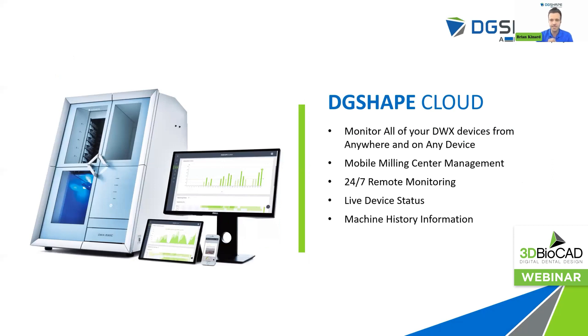DGSHAPE Cloud. We're excited to introduce this new software, which is free and comes with any owner of a new DWX device from Roland. This allows you to monitor all of your DWX devices — your 42W wet chair-side mill, your 52D, your 52D CI, and also your new 53DC. You can monitor your milling jobs from anywhere in the world. Maybe you have a milling center — you can manage it remotely with 24/7 remote monitoring, live device status, and job history information. It gives you peace of mind so you can keep a third eye on what's going on in your lab milling center.